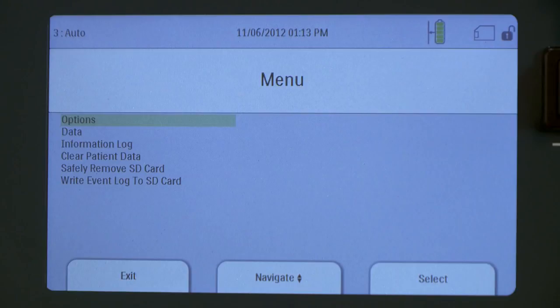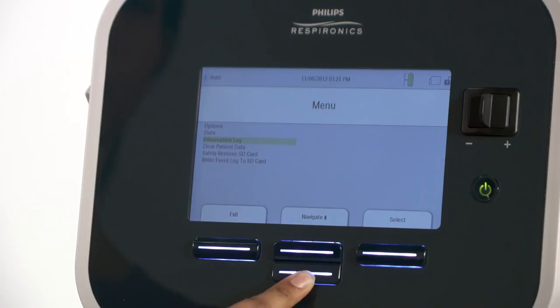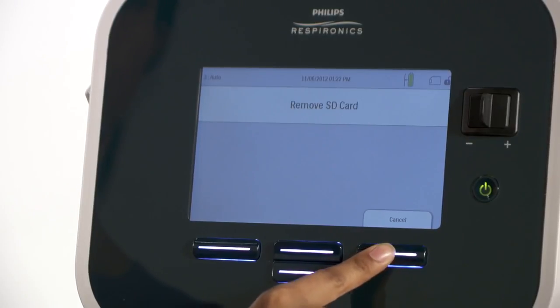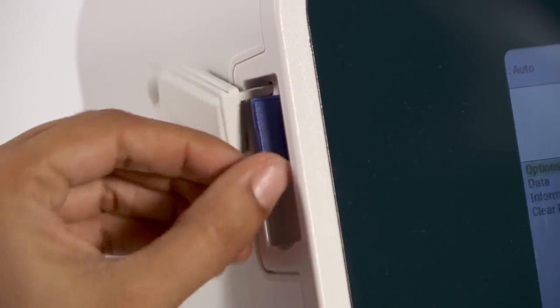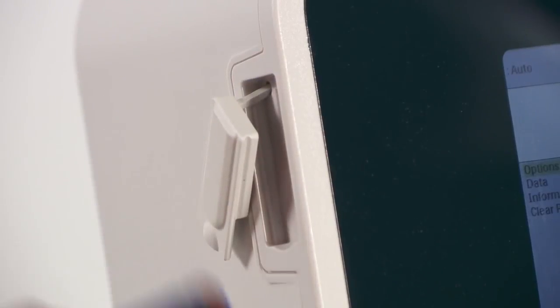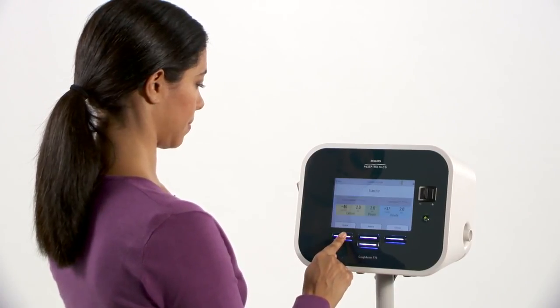You will see a list of items. Use the down button under navigate to move down the list until safely remove SD card is highlighted. Press the right button under select. A remove SD card message will appear to let you know that the card can be removed. Press the left button under exit to return to standby.